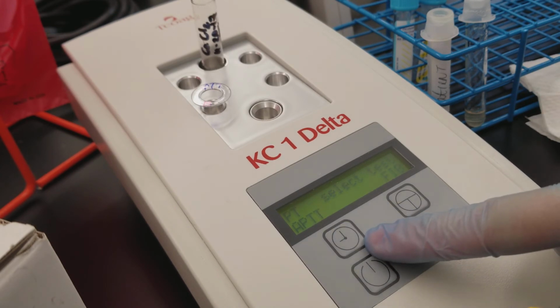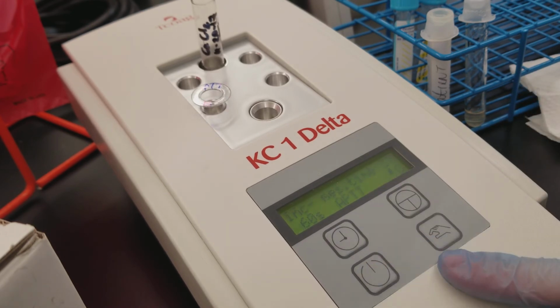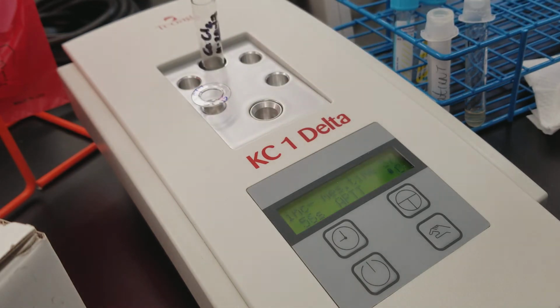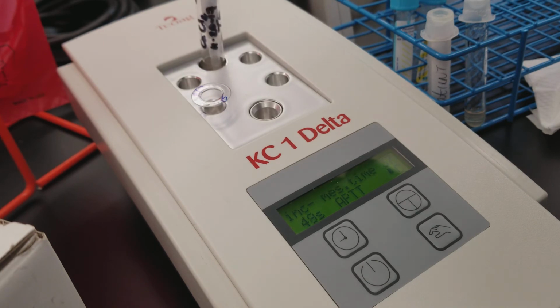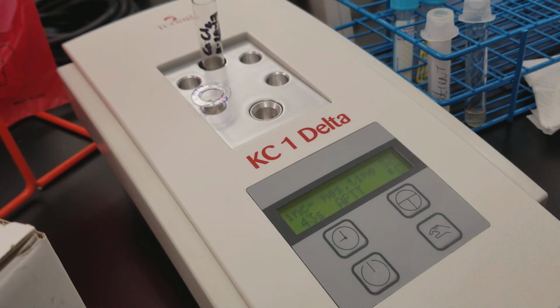In order to get back to the testing menu, you press the clock. All right, we're doing PTT again. We've already got the incubation time. I'm going to get my calcium chloride ready because you saw that I had already put the reagent in there. When it starts beeping at me and gets to zero immediately, I'm going to press the power looking button. So we'll try that again.